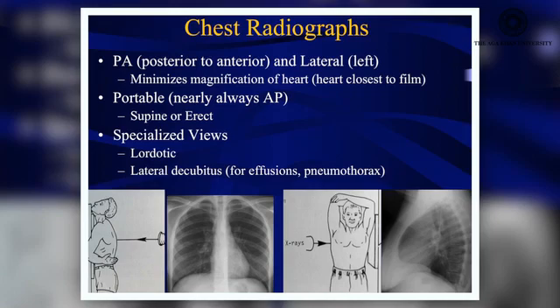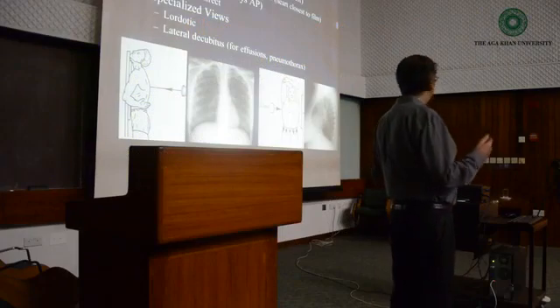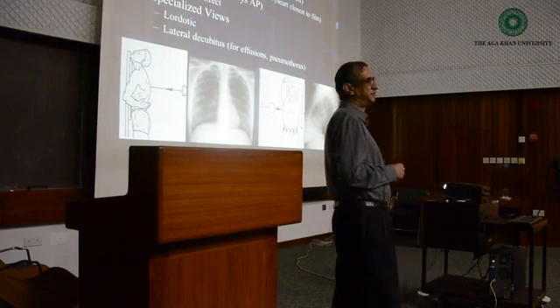So isn't the heart immediately beneath the image plate or X-ray film? And isn't it very near in a PA view? So if you reverse it, won't the distance of heart increase from the film? Understood? So if its distance increases from the heart, it's going to be magnified. So you don't want the heart to be magnified.